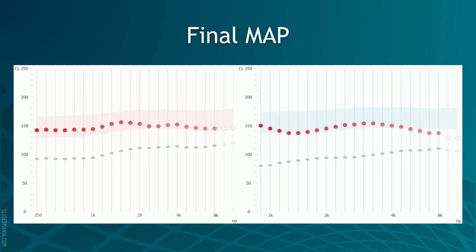And then also a lot of the C levels are right within that sort of shaded population mean. Not that that necessarily is indicative that you're doing your job 100% perfect. There are people who don't fall within population means just because of the definition of what a mean is. But it is sort of a subtle indicator that we might be onto something, just because this is more in line with a typical cochlear implant map instead of the wacky one we got presented with.